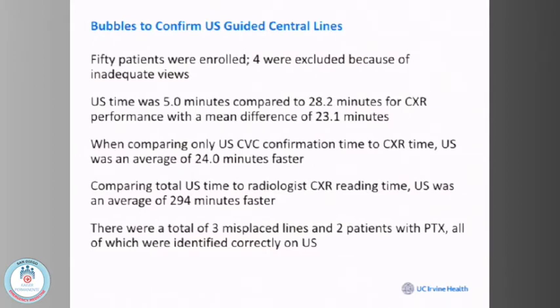But if you looked at how long it took to get a radiology read on these patients, it was like 294 minutes later. And so, there were 3 misplaced lines, 2 patients with pneumos. Everything got caught on ultrasound and correctly identified and repositioned on ultrasound.